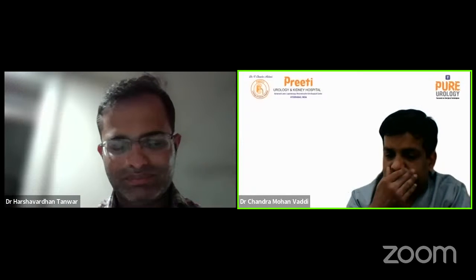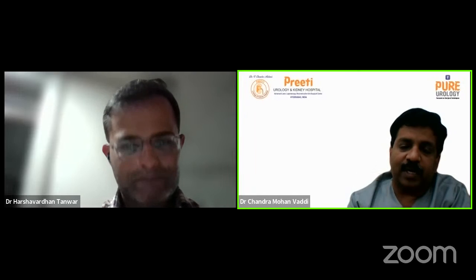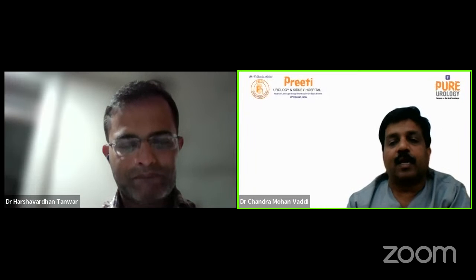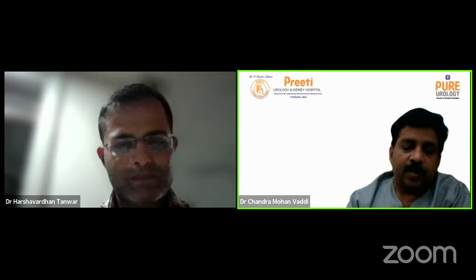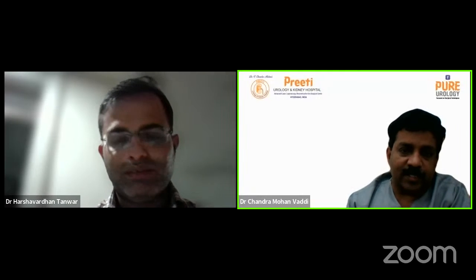Very few surgeons hit in one angle. They have the depth, but juniors who don't have a great perception of depth can rotate and see. Do you agree or not? They can rotate and see.